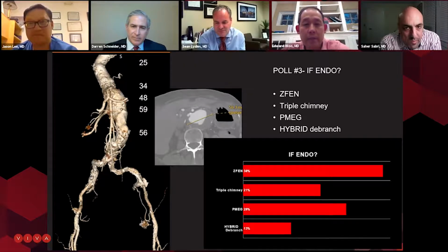The Pericles data uses all different types of endografts. We use a specific endograft when we do it, and the results we've had have been really excellent. Smaller numbers of gutter leaks. So Jason, take us through what you did.